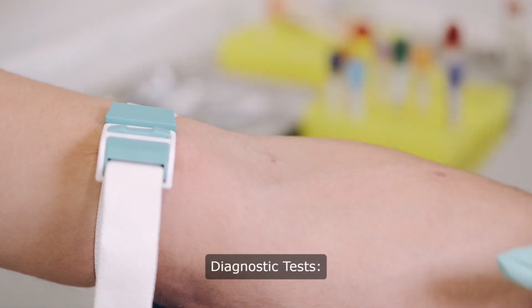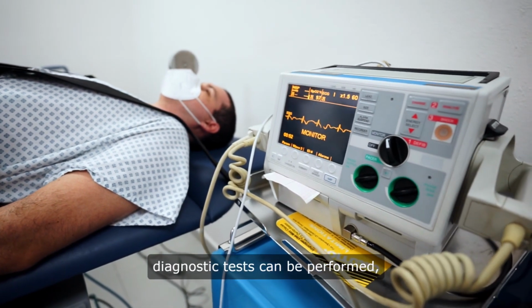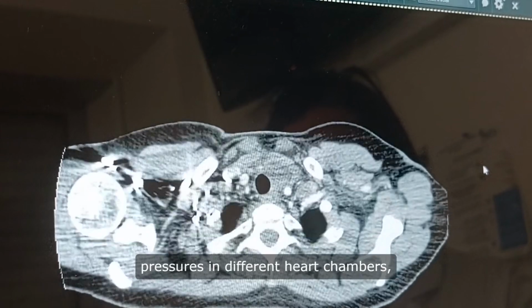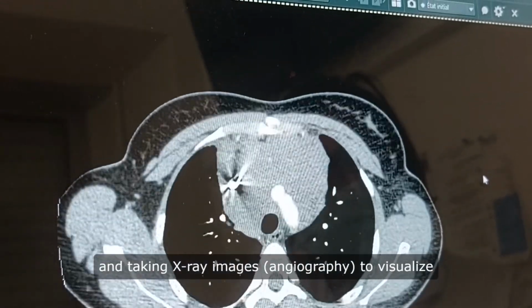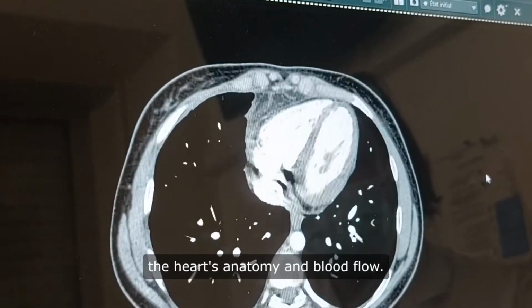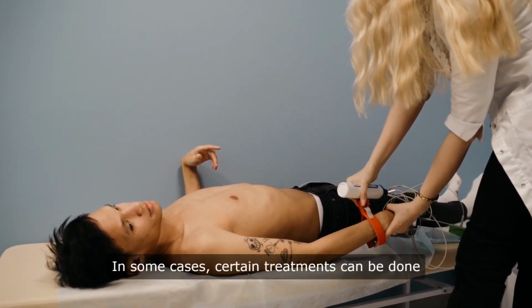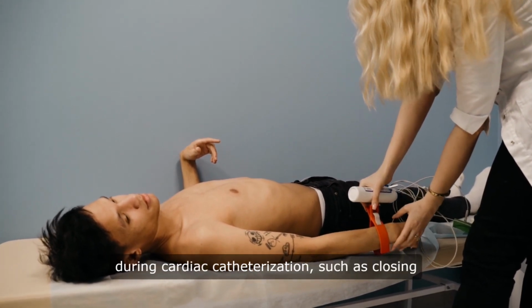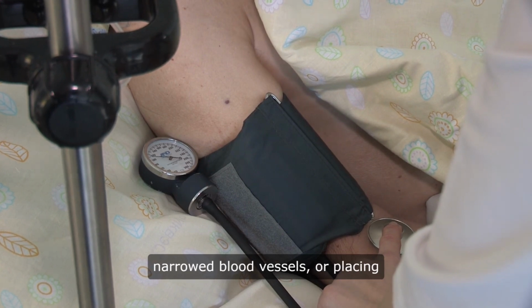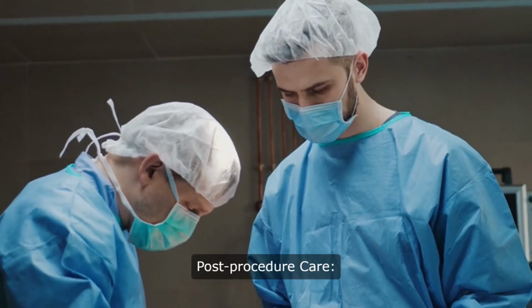Diagnostic tests. Once the catheter is in place, various diagnostic tests can be performed, such as measuring blood oxygen levels, pressures in different heart chambers, and taking X-ray images, angiography, to visualize the heart's anatomy and blood flow. Treatment, if needed. In some cases, certain treatments can be done during cardiac catheterization, such as closing small holes in the heart, widening narrowed blood vessels, or placing stents to keep blood vessels open.